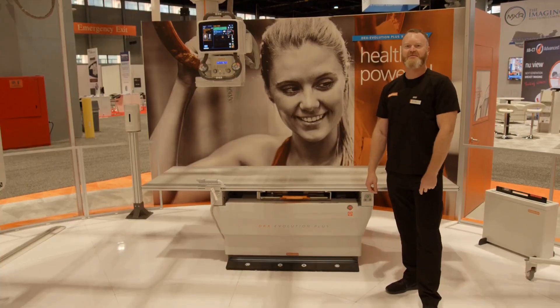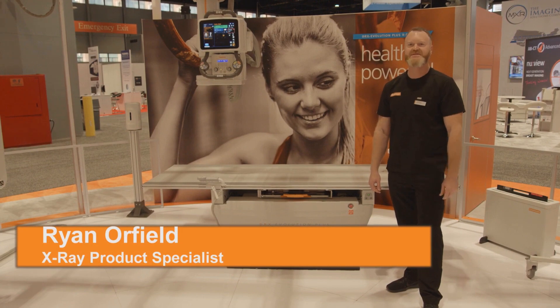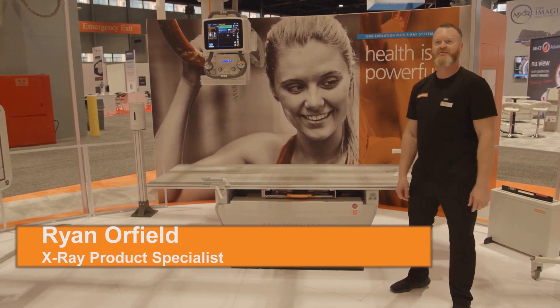Hello, here we are at the DRX Evolution Plus. This is our flagship product featuring high-end performance and full motorization for an excellent customer experience.